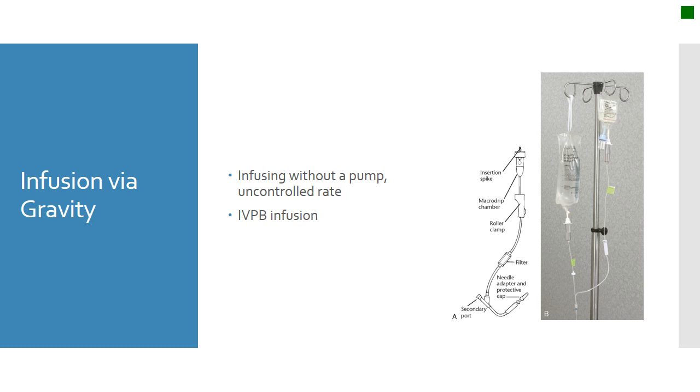Now we have infusion by gravity. You can hook up a saline bag or whatever type of solution to a patient without a pump, and therefore it is only infusing by gravity. You have to be mindful of this because not all of the medication or solution may be infused once the volume gets to a certain lower level. You may need to increase the height of the bag in order for it to infuse by gravity.